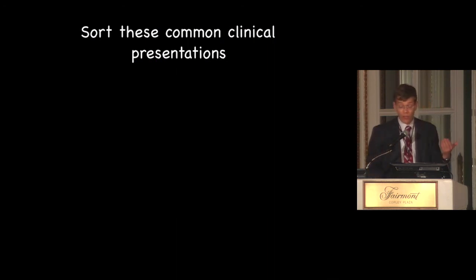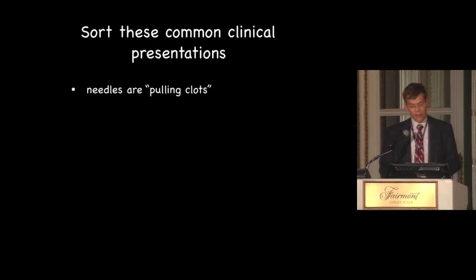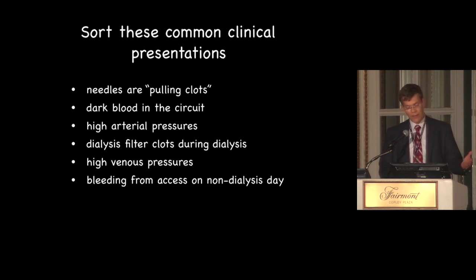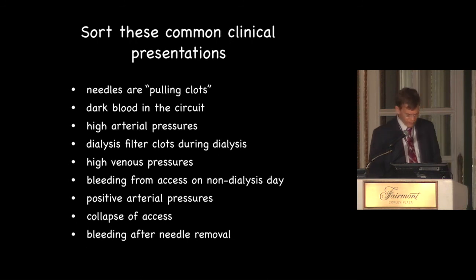So we've talked a lot about physical exam, and nurses often have a specific lingo that they use to present problems to nephrologists or interventionalists. They may say: needles are pulling clots, dark blood in the circuit, high arterial pressures, dialysis filter clots during dialysis, high venous pressure, bleeding from access on non-dialysis days, positive arterial pressures, collapse of the access when they turn the machine on, or bleeding after needle removal.